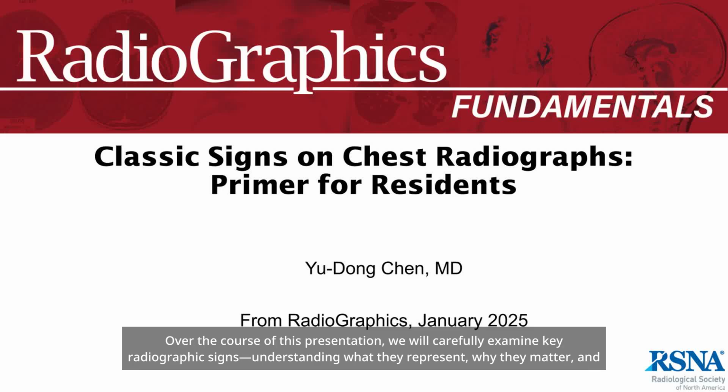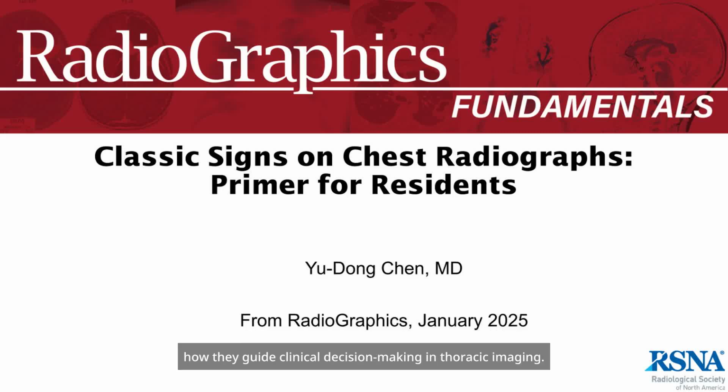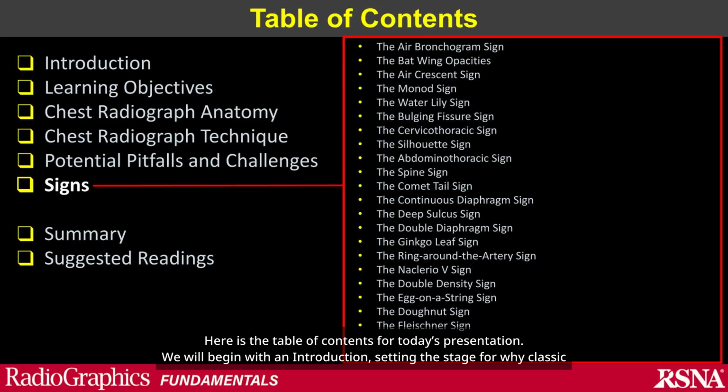Over the course of this presentation, we will carefully examine key radiographic signs, understanding what they represent, why they matter, and how they guide clinical decision-making in thoracic imaging. Here is the table of contents for today's presentation.